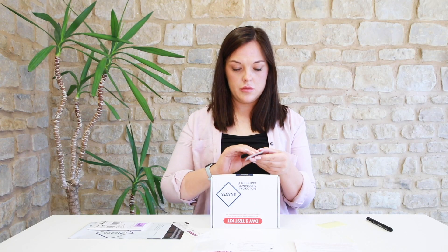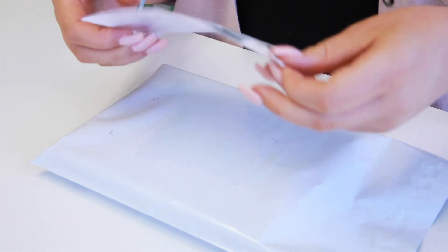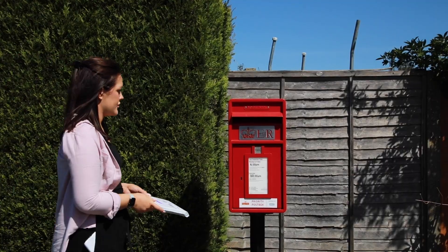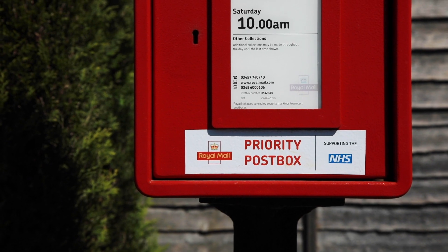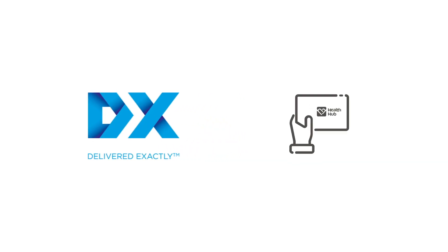Step 3: Posting your sample. Insert the box into the return bag provided and apply the return shipping label to the returns bag. Please post your test back to the lab immediately, checking the post box collection times. You must use a Royal Mail priority post box, unless you have paid for DX tracked specimen return or are returning your sample.